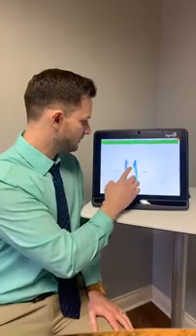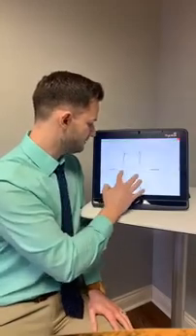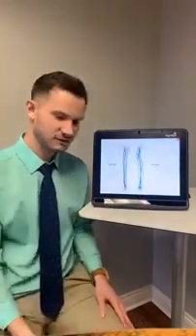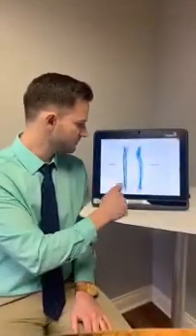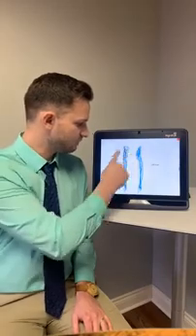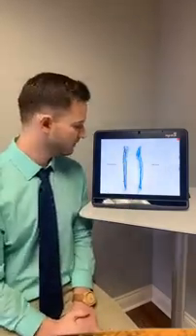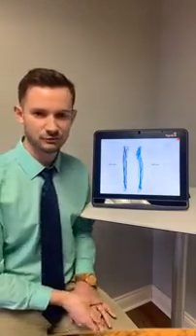And the next one is vertical, making quick jumps vertically. And once again, this patient did better going up and down. You can see the difference. It's a very similar flight path over and over. Pretty close to the bullseye every time. All four bullseyes are fairly consistently hit. And not so many of those zigzag, not able to repeat the pattern over and over.